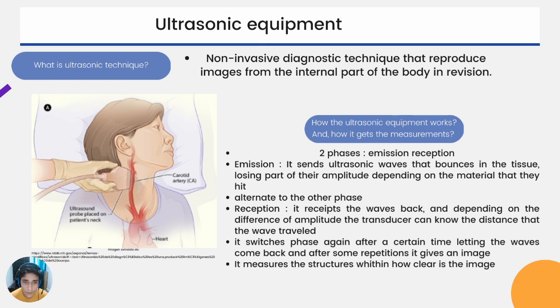What is the ultrasonic technique? It's a non-invasive diagnostic technique that reproduces images from the internal parts of the body under revision. How does the ultrasonic equipment work and how does it get the measurements?